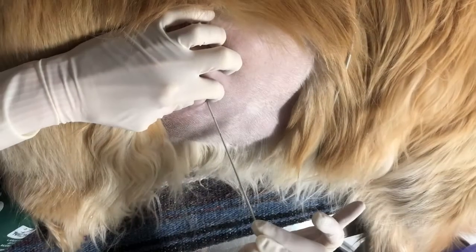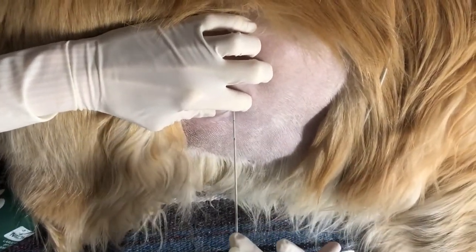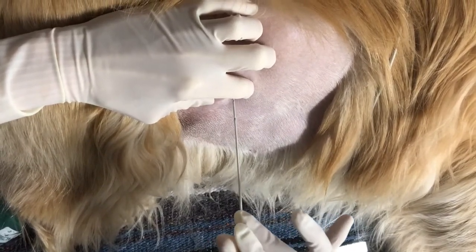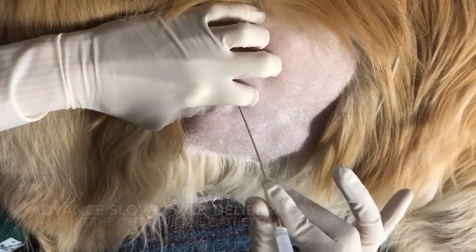Get your catheter — remember that this is just like a gigantic IV catheter. If you look at the tip, you will notice that the stylet protrudes a couple millimeters beyond where the actual Teflon catheter starts. Begin to slowly advance the catheter through the skin, creeping along the cranial aspect of the rib. If you feel a gentle scratch along the rib, that can help you gauge your depth as you're advancing the catheter into the chest cavity.